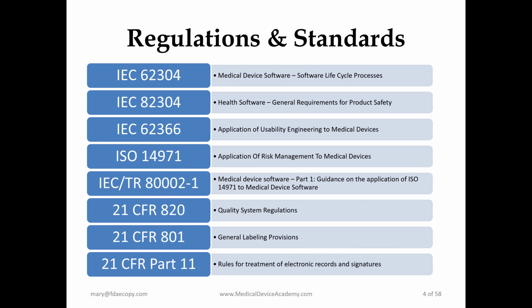Devices that would be subjected to IEC 82304 would also be subjected to 62304, but it's just a more specific document for those types of devices. IEC 62366 is the application of usability engineering to medical devices, which is the recognized consensus standard that's called out in 62304. And then obviously 14971 is the general application of risk management to medical devices.